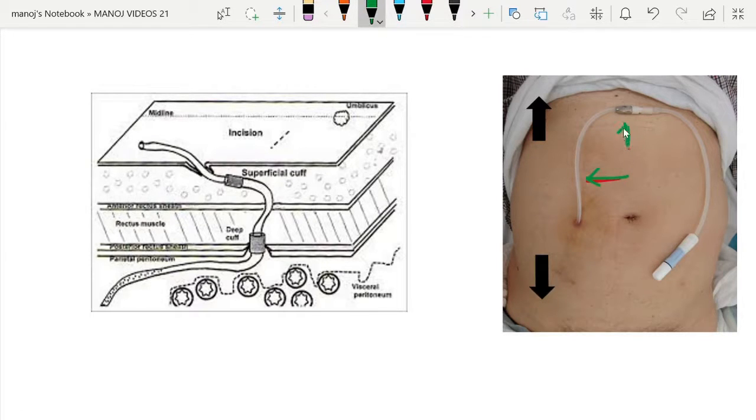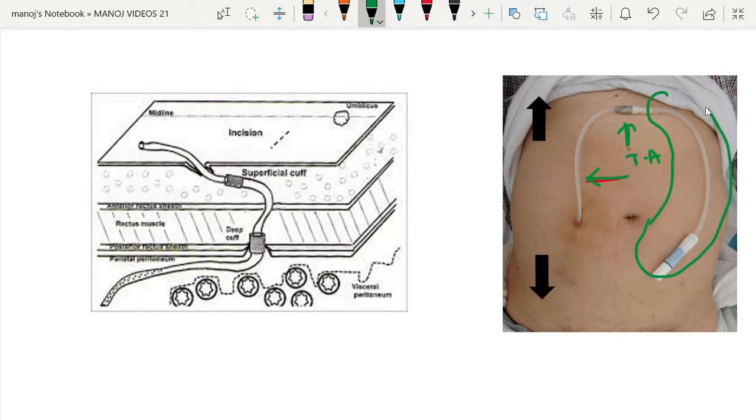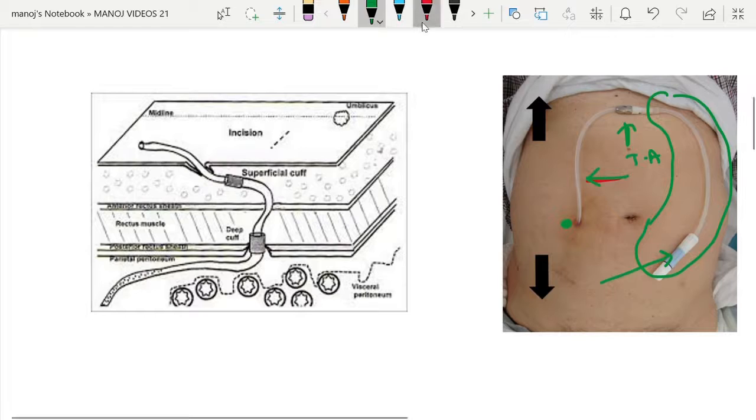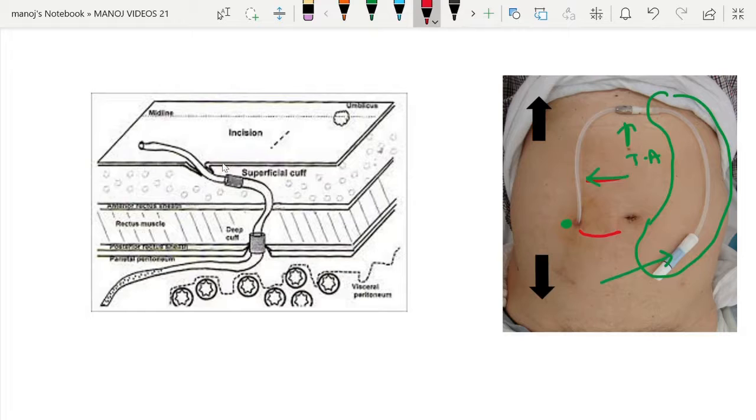The titanium adapter and after this is the transfer set twist clamp. This is the part of the catheter. This is the exit site, and as we see here the catheter is going in like this.